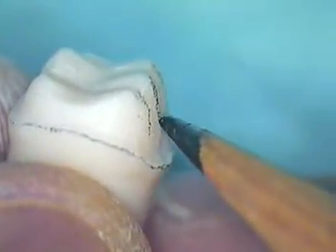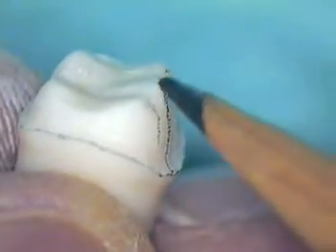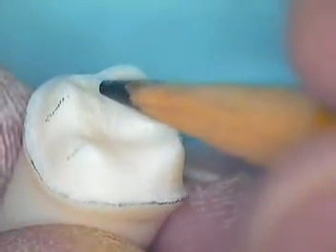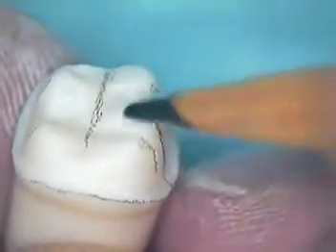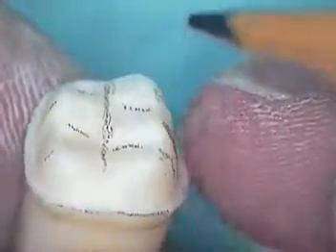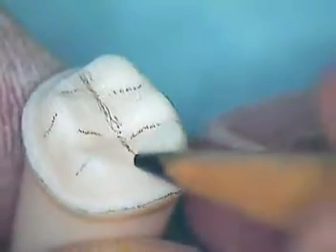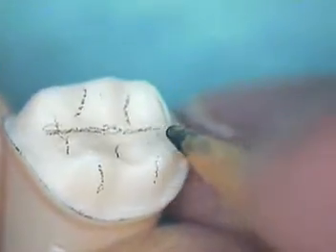We'll blow that up and take a close look from the cusp height all the way to the margin — it looks like an S. For the occlusal reduction, the central groove area is all uniform, and we followed the grooves of the tooth to stay consistent, keeping the occlusal rolling as well for its reduction.